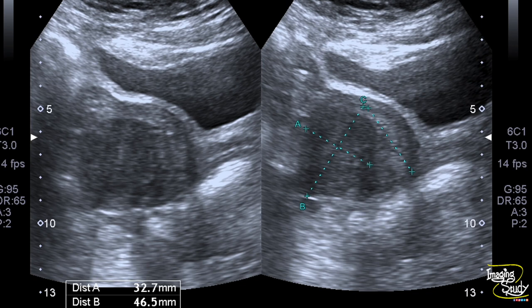Here is the picture of the uterus, and in the left picture you can see this hypoechoic area looks like a fibroid. In my last video I told you about the echogenic pseudocapsule. This hyperechogenic structure looks like that pseudocapsule. However, it is the endometrium, and you can see I have drawn the endometrium for measurement.